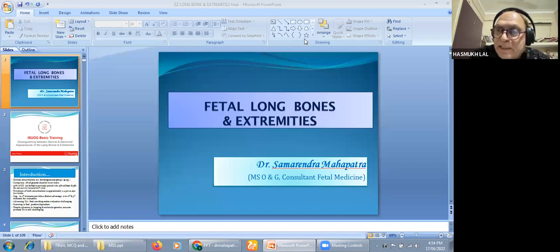And as I said, in obese patients the first trimester is always much better because the uterus and the fetus have not come up to the abdomen. It is still in the pelvic cavity, so there is not much adipose tissue, which is a hindrance to the ultrasound beam.